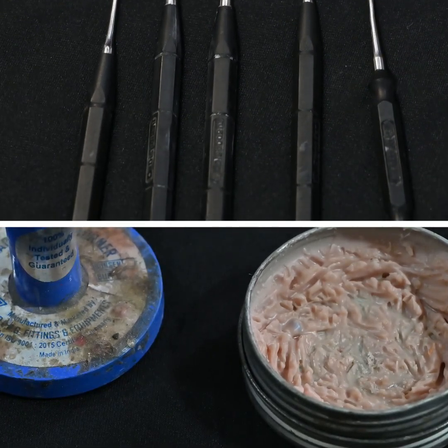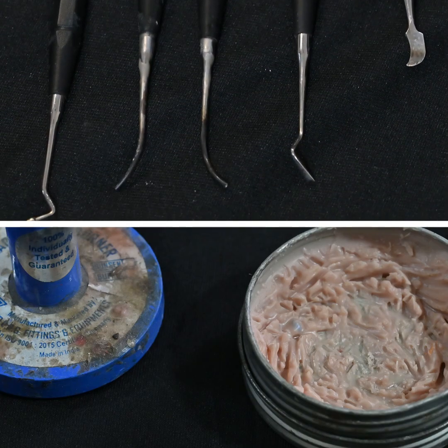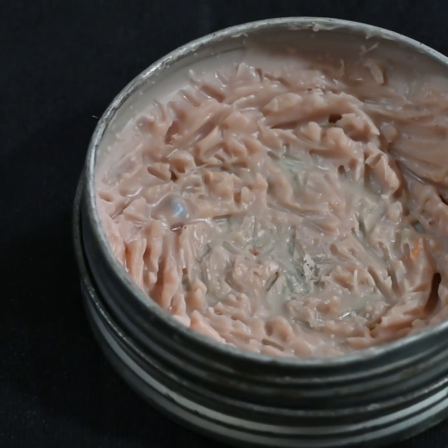This is the mock-up wax and these are the PKT instruments. All you need is a burner, a wax dropper, and the mock-up wax.